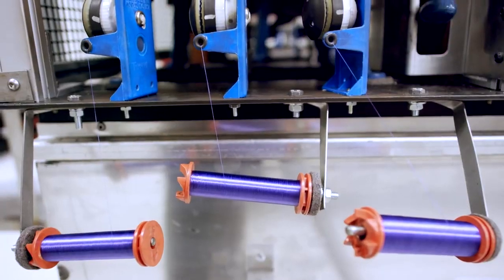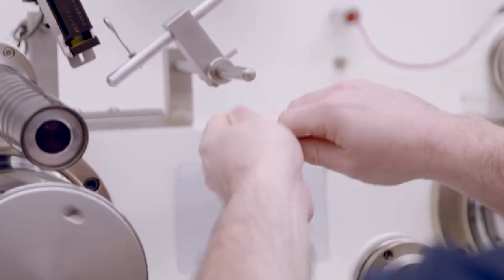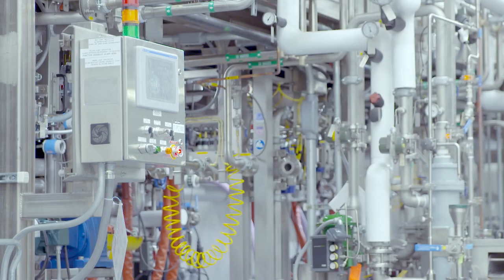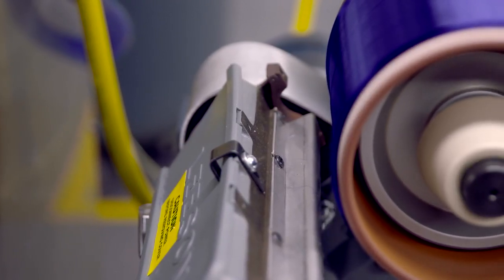I went there and it was so fascinating to see how difficult this is. The delicacy of especially the smaller sutures and how much individual work goes into each one. Sutures are designed at the molecular level. Different chemical components and manufacturing processes determine a thread's properties. Each is designed for a specific job and tissue layer.